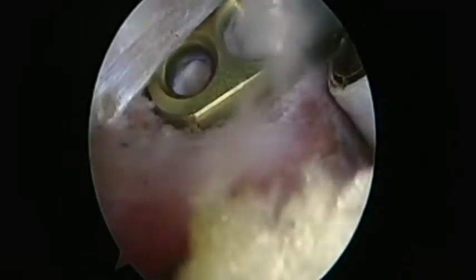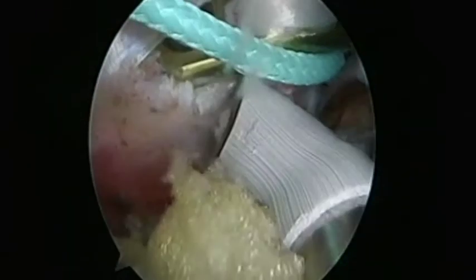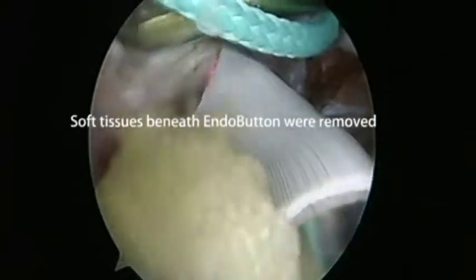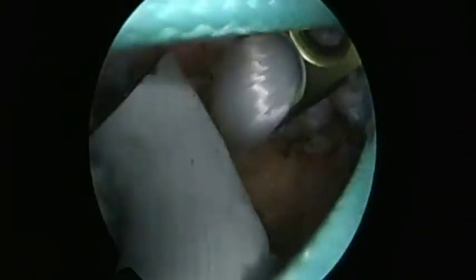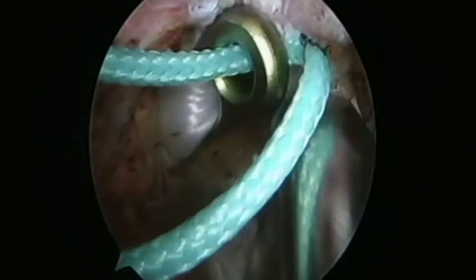A probe can be inserted through the same portal to help manipulate the endobutton into the proper position against the lateral cortex of the femur by pulling the graft at the tibial side.